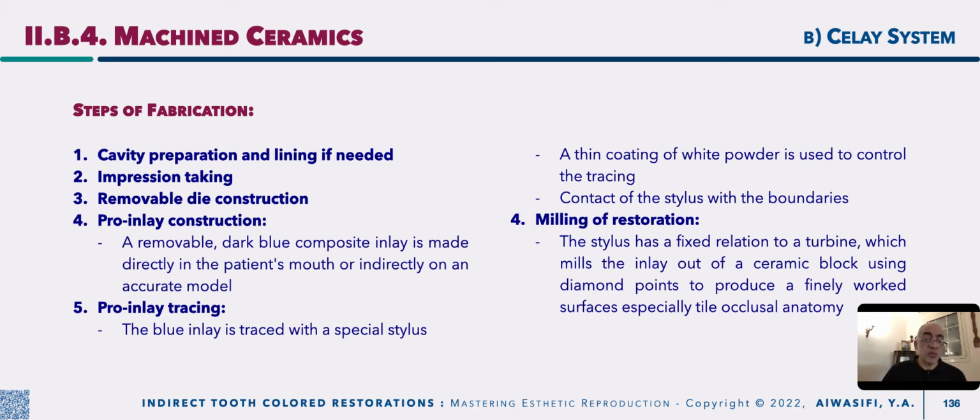Then the pro inlay is traced. To ensure that you are tracing all the area and all the anatomical features of the fitting surface and outer surface of your inlay, it is powdered with white powder. Why? Because when the tracer is run along your surface, it will erase this white powder, denoting the blue color of your pro inlay and indicating that this area is properly traced.